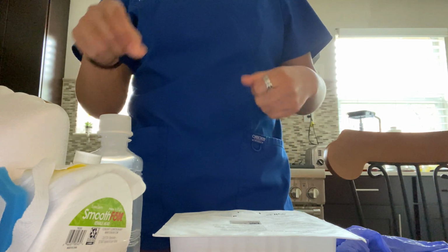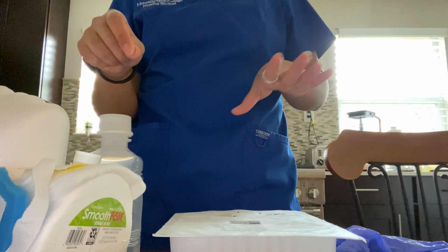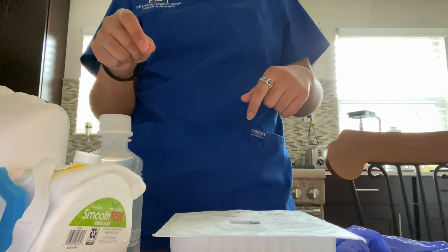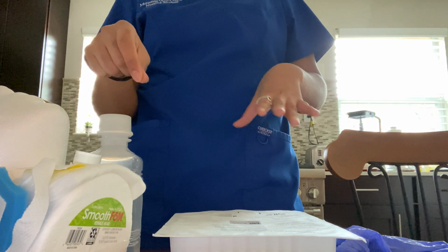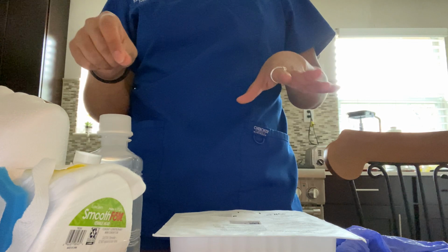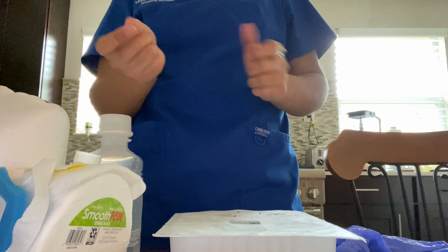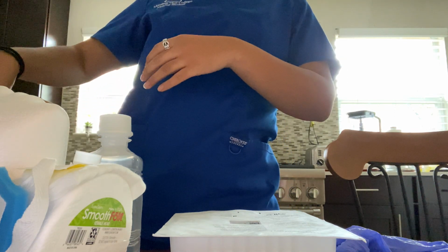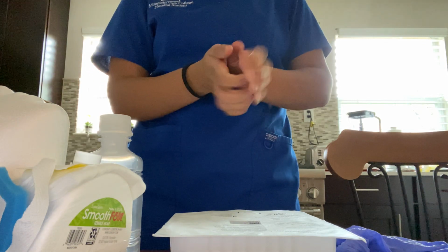So after that, the suction is over. You roll up the catheter with the glove. That is the end of your sterile part for suctioning. So you're going to clean next. You're just going to roll up the catheter in your hand, then throw your gloves away and perform hand hygiene. So I perform my hand hygiene.